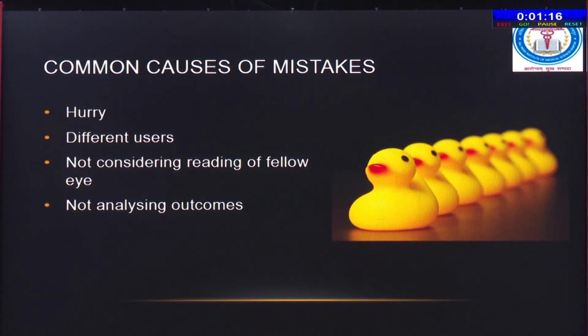Another point is that the residents in many centers are in a sort of hurry. 100 patients from the camp have come and they have to do biometry of all the patients. So they are in a sort of hurry, and hurry anywhere commits mistakes. The second thing is the different users. If 2 residents are on night duty, one takes the charge of doing the keratometry, while the second takes the charge of putting in the readings and doing biometry. And there comes the biggest cause of error.